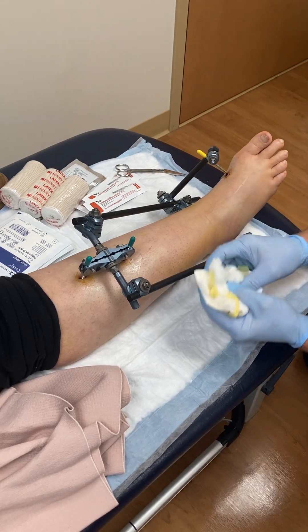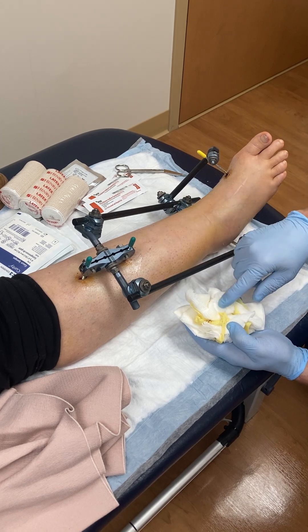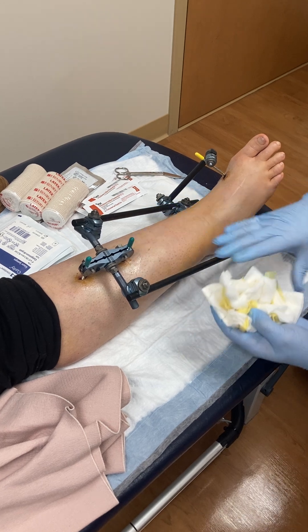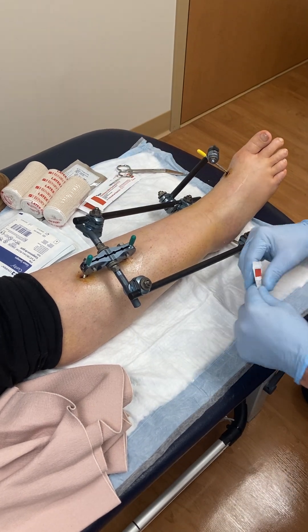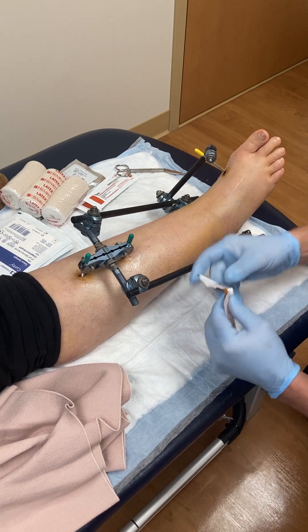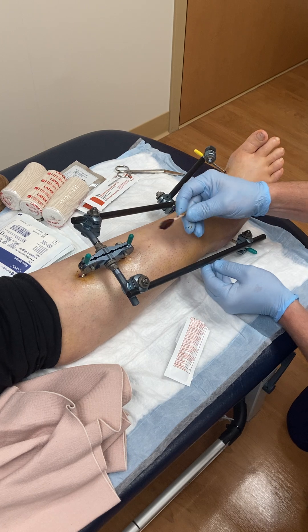What I do is remove all of these dressing items. They've been doing betadine cleansing, which I'll show you how to do, and they've been putting Xeroform on there and then gauze around the pins. At this point things are clean enough that we don't have to continue with the Xeroform gauze — that yellow gauze is used for the first few days and then we just go to betadine and sterile gauze.